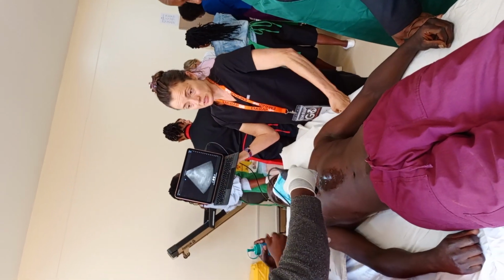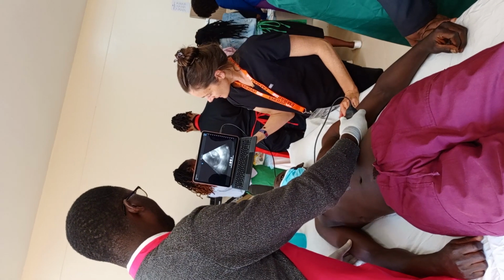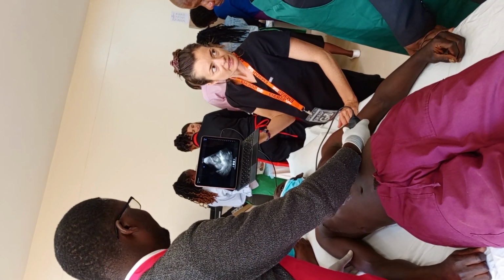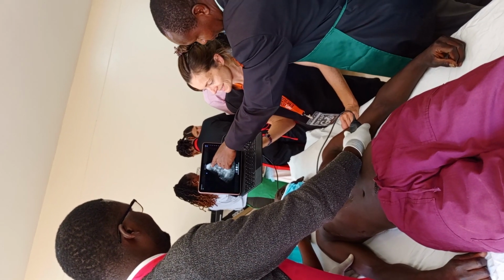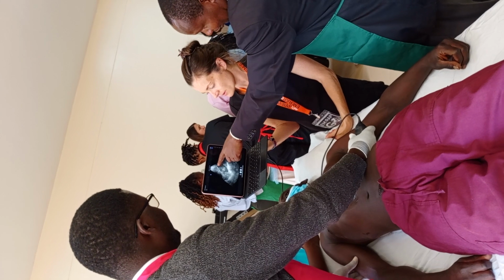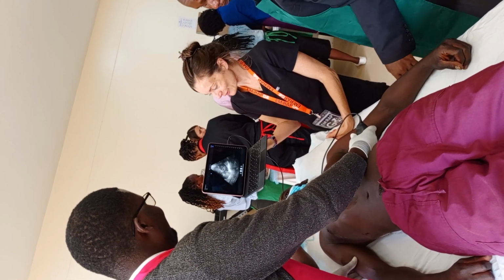Remember, this is more posterior and superior. Okay, can someone point out the spleen? Where's the spleen? Yes, this is the spleen. And where's the kidney? And where's that recess? Recess, perfect, beautiful. Okay, and then our last view.